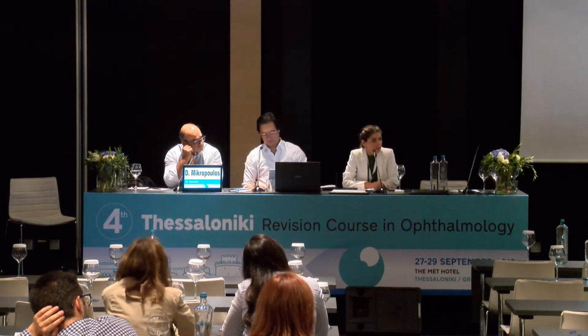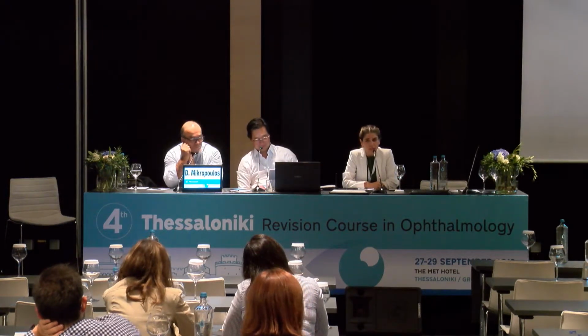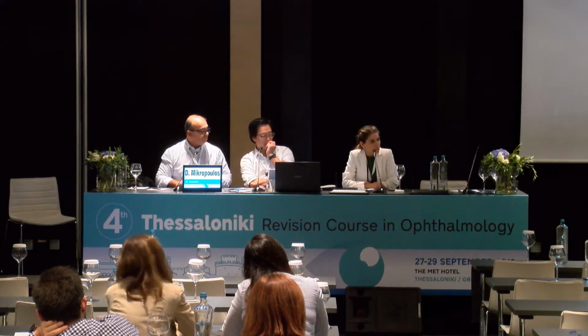I think that especially for diagnosis, it would make sense. It would also make sense to do a 10-2 visual field, especially for these patients where you don't know what's happening.